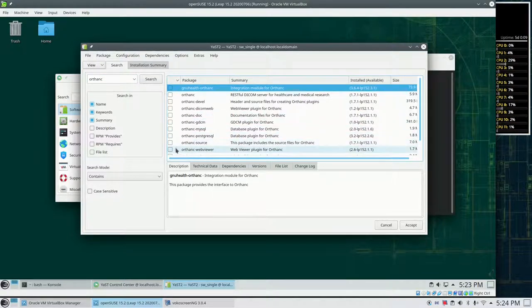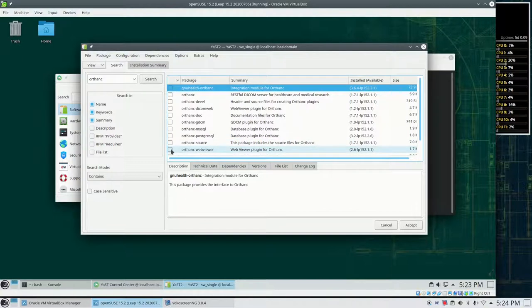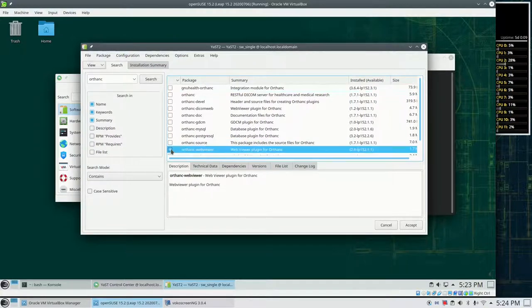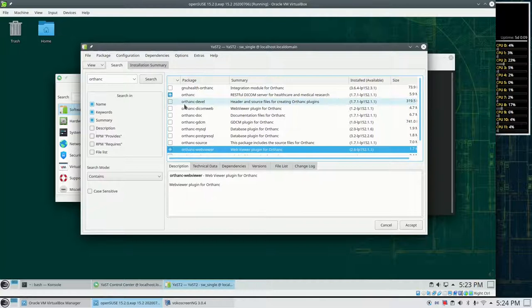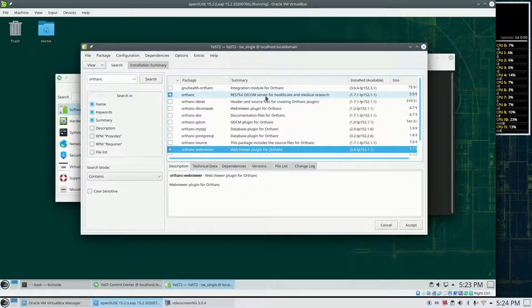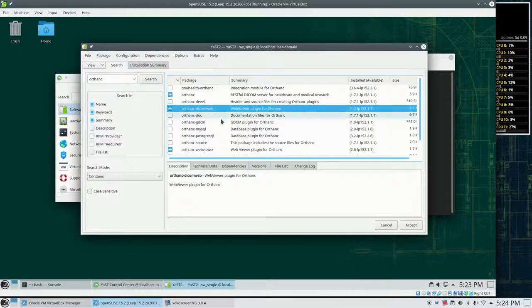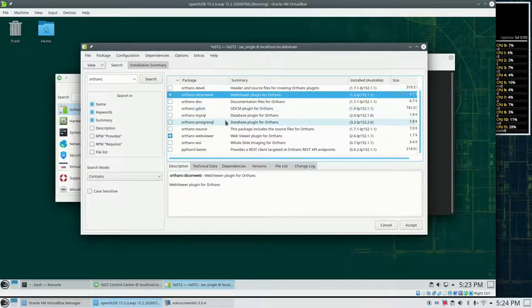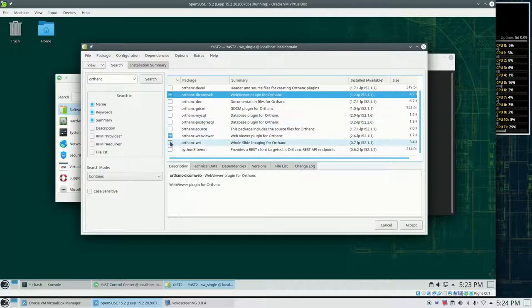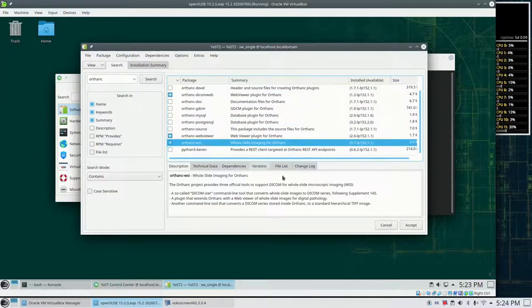So let's install a couple of plugins because if I select a plugin it should automatically select the server as well. This is working. So I use DICOM Web, the Web Viewer, and the whole slide imaging.